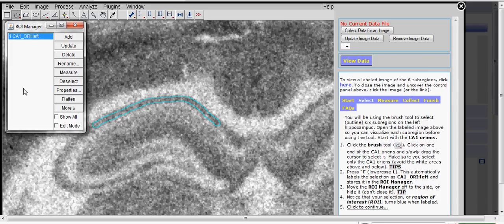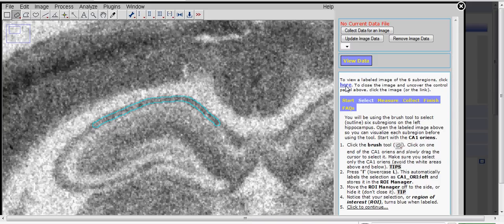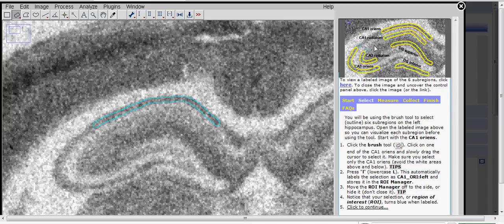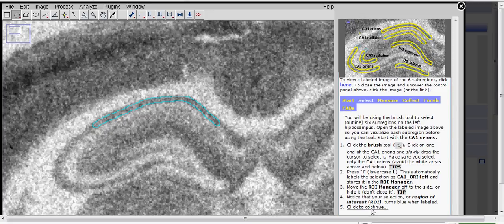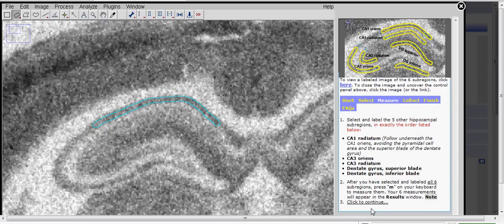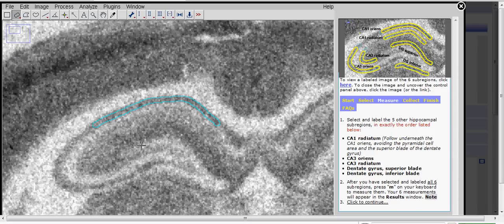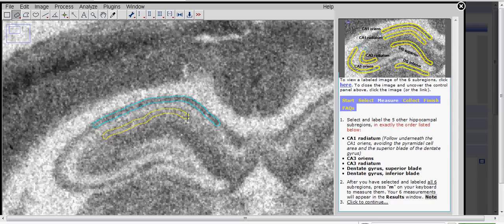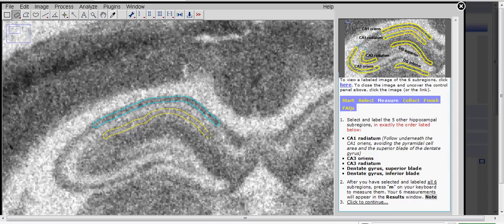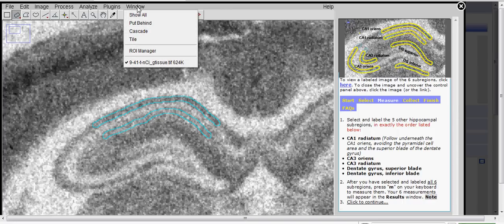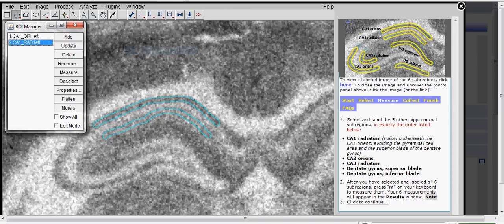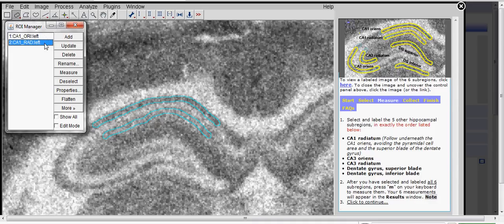I'm going to go ahead and go over to the instructions side again and click on the labeled image. You can see all six regions we're going to be selecting. And then we will move on to the next set of instructions. The second region is the CA1 Radiatum. And even though I didn't do a perfect job of selecting that region, it isn't going to matter. The data are robust enough that small errors will not affect the analysis we're going to run. I'm going to click L and label that one. You can check in your ROI Manager to see which regions you've already selected by pulling down the window menu. And you'll see we now have the first two regions. Now I'm going to go to the third region, the CA3 Oriens. Click and drag and press L.